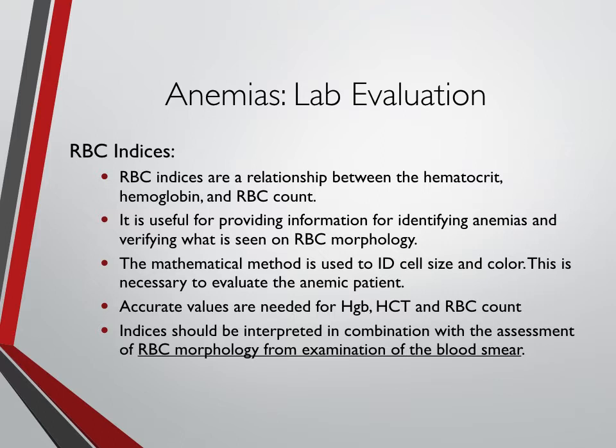And that just comes back to the blood smear. Our automated machines are really important and extremely helpful, but the eyes and the knowledge of a technician is really going to be important to correlate these two information systems.